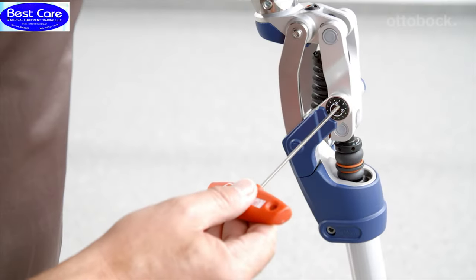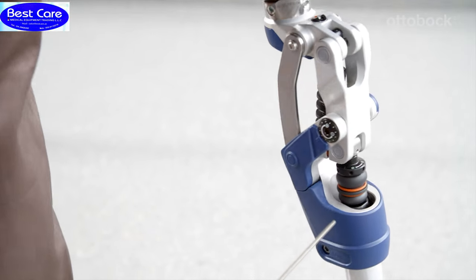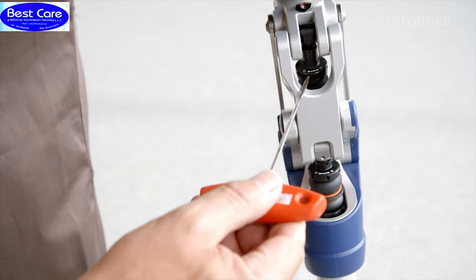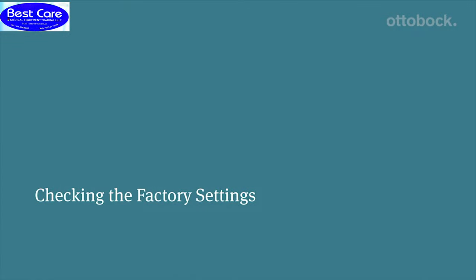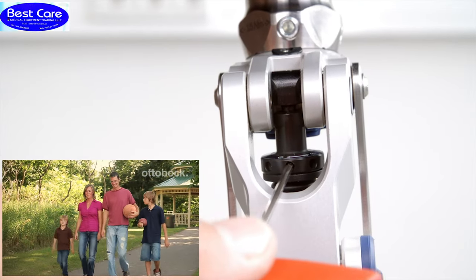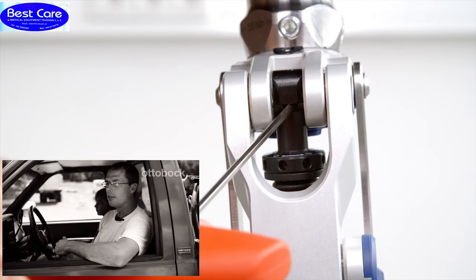The following adjustments can be made with PHEON: swing phase friction, the ergonomically balanced stride, EBS, and the extension assist. Please check the factory settings before fitting the user. The factory settings of the extension assist need to be restored so that a gap of approximately 1.5 millimeters can be seen above the adjustment ring.